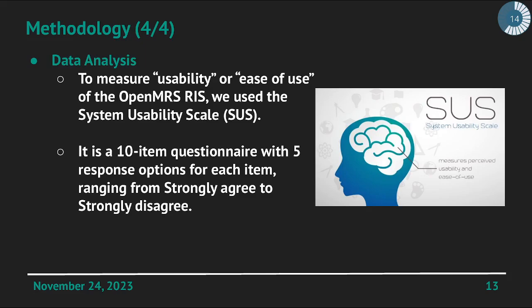Finally, data analysis was carried out. To measure usability or ease of use of the OpenMRS Radiology Information System, we used the System Usability Scale. This is a 10-item questionnaire with 5 response options for each item, ranging from strongly agree to strongly disagree.